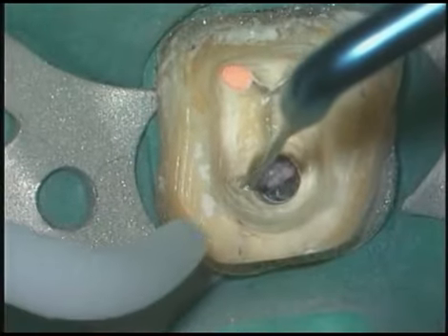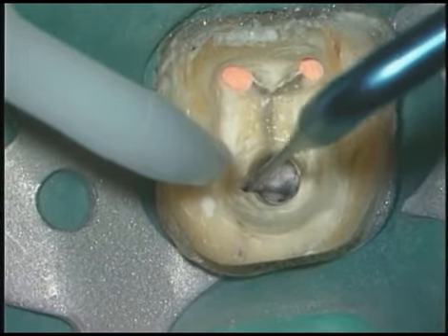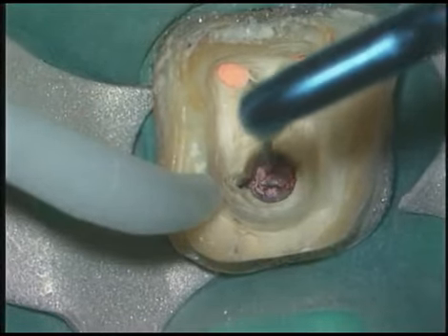Now, if you look down that distal orifice, you begin to see that there's a little eccentricity off towards the lingual. The titanium tip rapidly removes obturation material from that, which is no doubt the orifice of a second system.